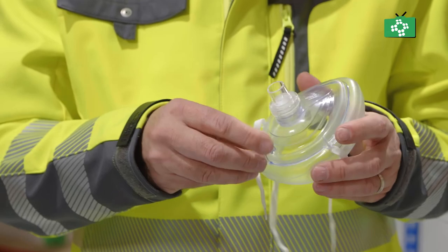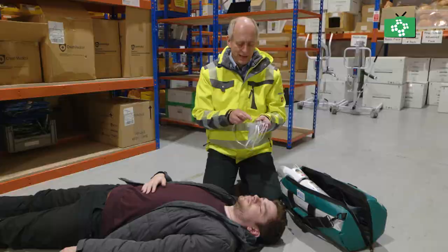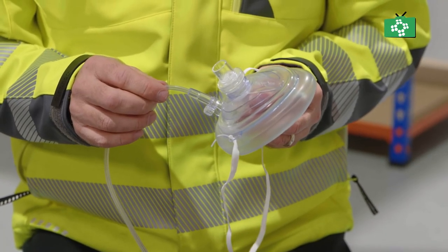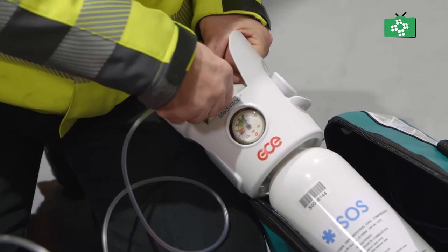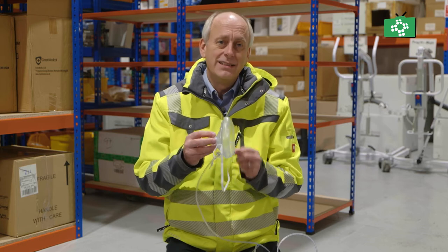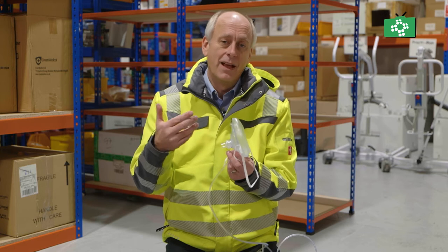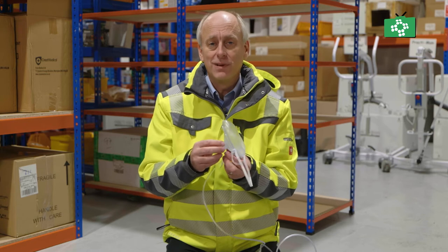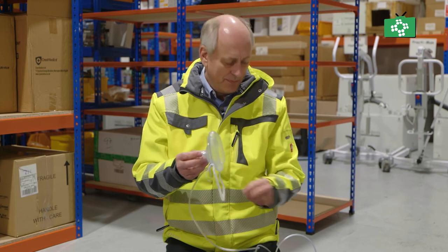This little valve here has got a little cap on and you can pull that cap off. What you can do is put a piece of oxygen tubing just onto it — they're all push fit, you don't need to do anything more, just literally push that in place. Now the oxygen tube is on. You then connect the other end onto the outlet of the O2 cylinder. Now you've got supplementary oxygen, and instead of just blowing in air we exhale which is around about 16%, we're supplementing with 100% oxygen, so we can increase the amount of oxygen we're blowing in by around about 50%.